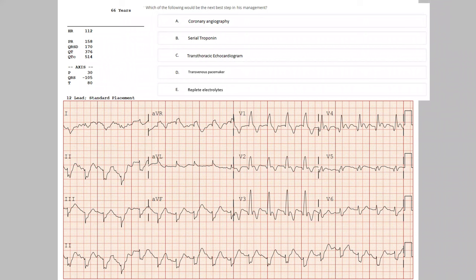New onset RBBB. Again, okay, so new onset RBBB is... But the clinical context is very important, right? Yeah. I'll go for C. So, Rafique bhai, do you want to poll or just move forward? No, I think this is a question of opinion.